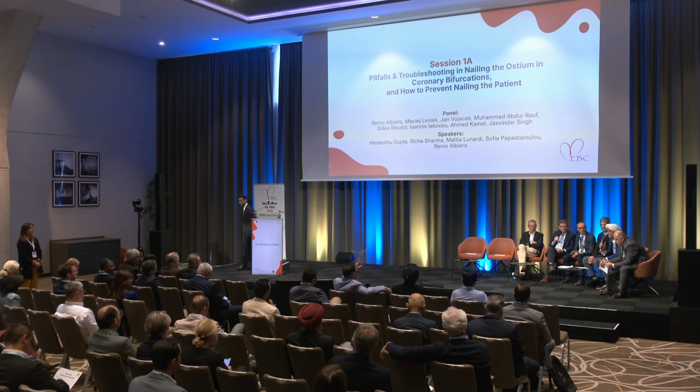The other comment I have is the rotablator technique was very good. A 1.25 burr is not a good idea. It gets trapped. Go 1.5 to at least 1.75. And what it does, like in underexpanded stents, it actually creates heat. So you want to create as much heat as you can to really melt and break the stent struts.